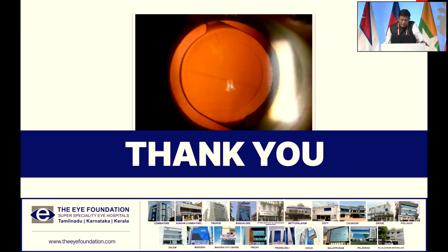So basically toric intraocular lenses have come to stay, and in many practices, almost 60 to 70% of our lenses are toric lenses, and once you understand these lenses completely and deal with any problem that arises out of them, you can give the optimal results. Thank you so much for your kind attention.